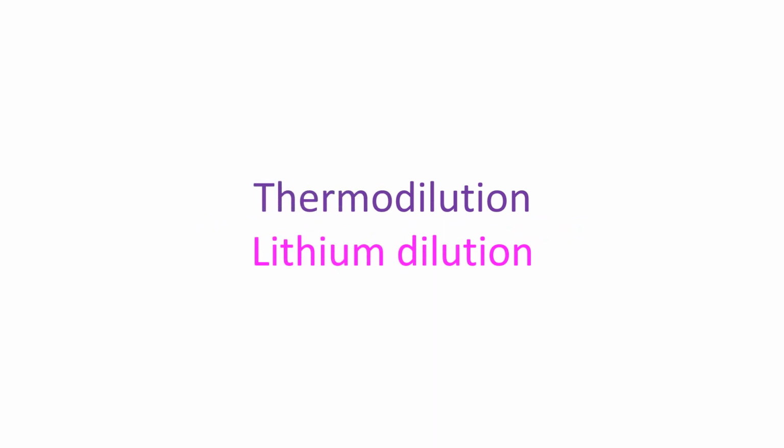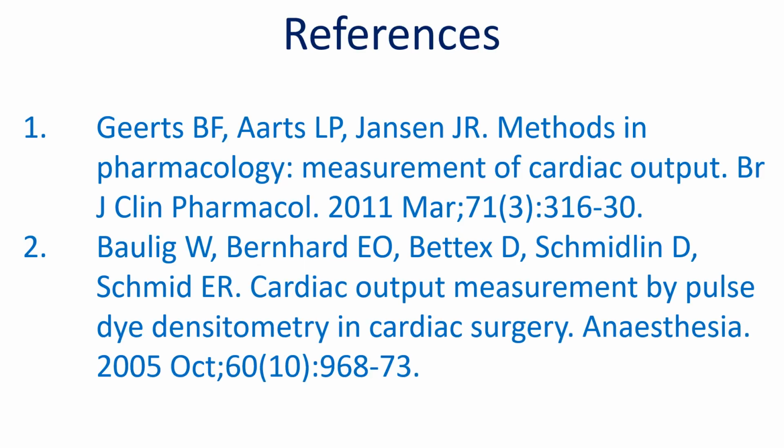patient's forefinger. Other modalities using the principle of indicator dilution technique which are used commercially are pulmonary artery catheter thermodilution methods and transpulmonary lithium bolus dilution method. Pulmonary artery thermodilution methods are thermodilution with bolus injection of cold saline, continuous thermodilution method, and transpulmonary thermodilution methods. All indicator dilution techniques assume complete mixing of indicator in blood with no loss of indicator between the place of injection and place of detection.